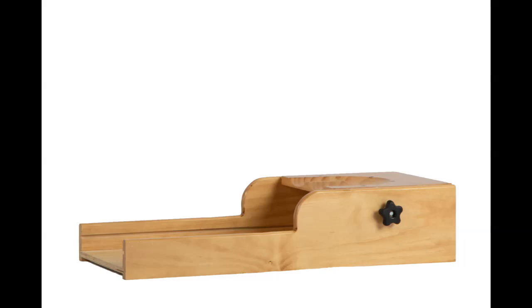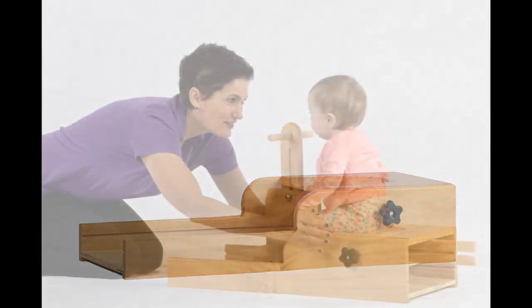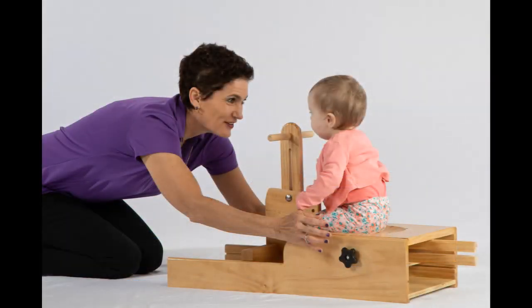Annie's chair was originally designed because as a physical therapist I often used a small step stool for my baby, six months to 24 months. I did this to get their feet flat, knees and hips at 90 degrees, and good thigh contact. All of this allows babies to be better grounded with weight through their feet.